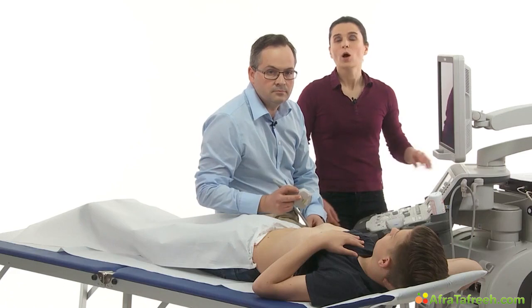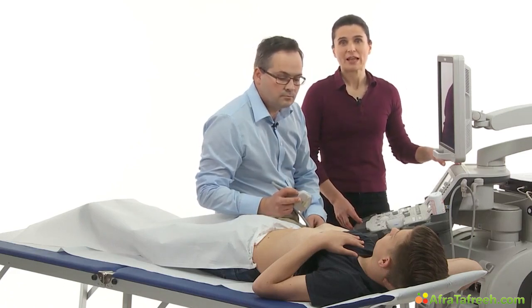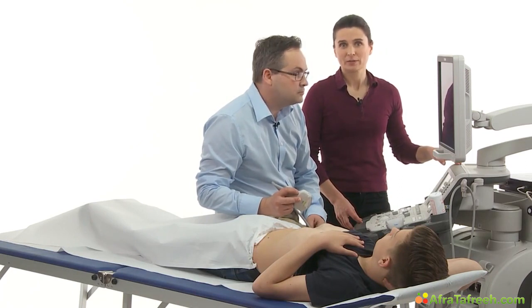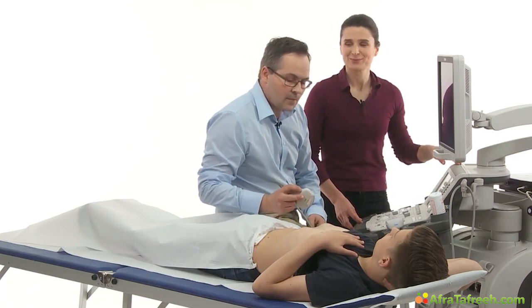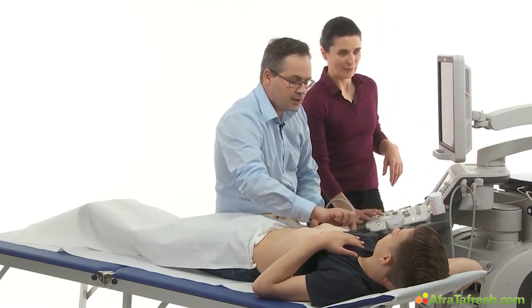Nicely to see. What about an emergency situation when we can't position our patient and have to get a quick look at the gallbladder? We've got a solution for you. In this particular case, I would prefer the intercostal approach for the gallbladder.